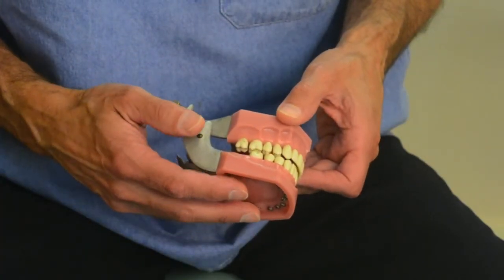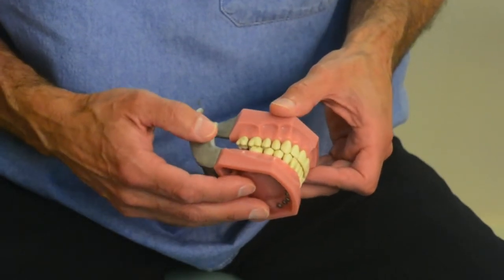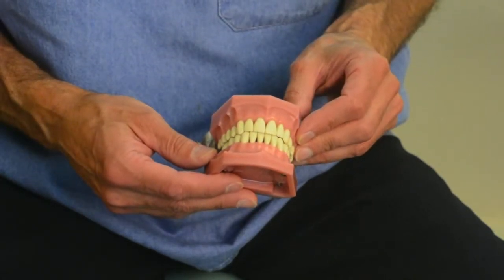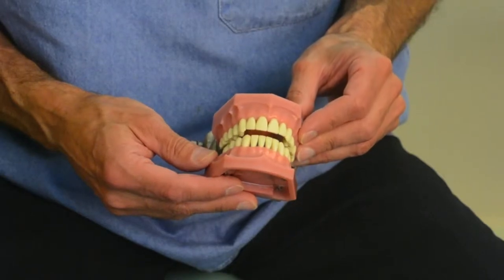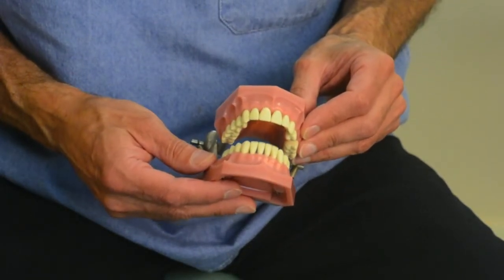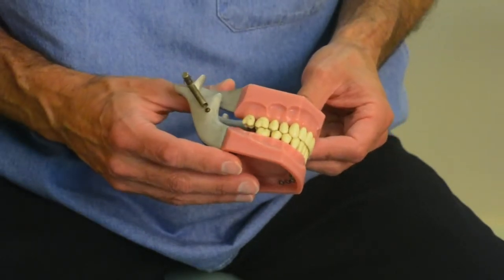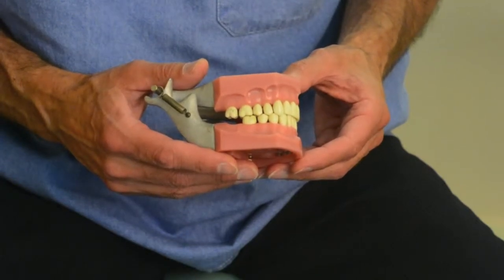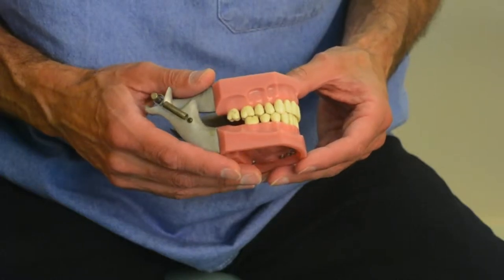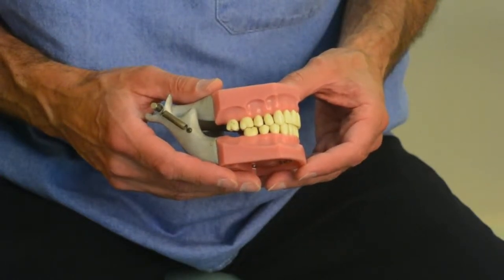Following the administration of your mandibular block injections with the Akinosi technique, you might find that the patient's opening may improve from very slight — maybe 5 to 10 millimeters — to maybe 25 to 30 millimeters. The main reason patients cannot open their mouth following a mandibular fracture is due to guarding because it hurts. However, once you've given your block injections, it's more than likely the patient is still not numb enough to allow you to work on them.